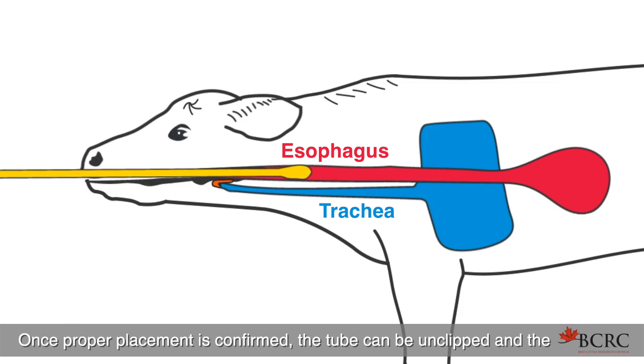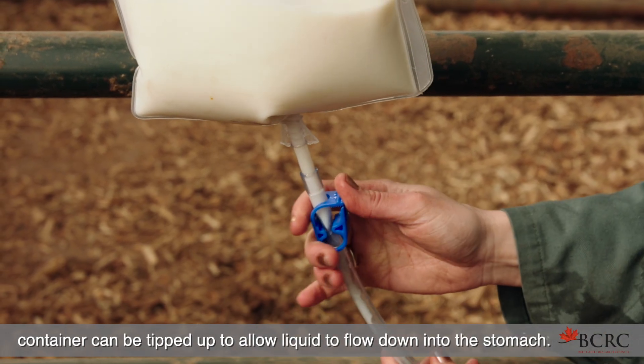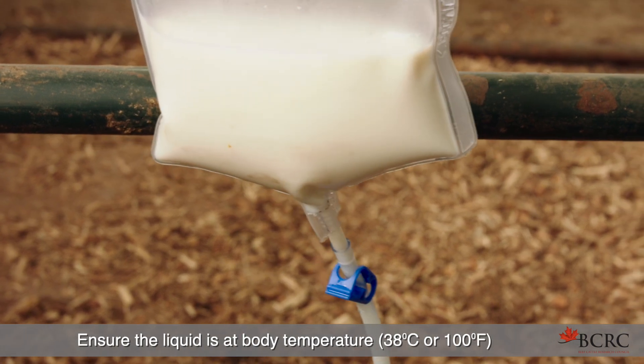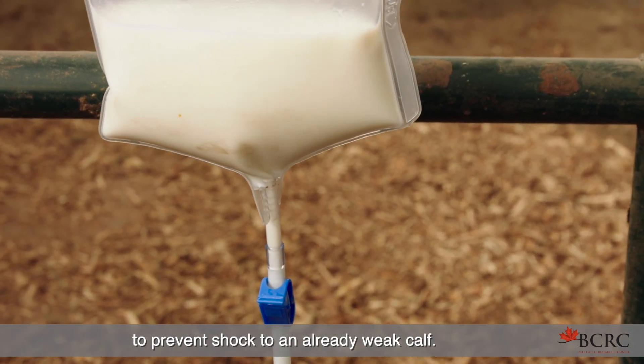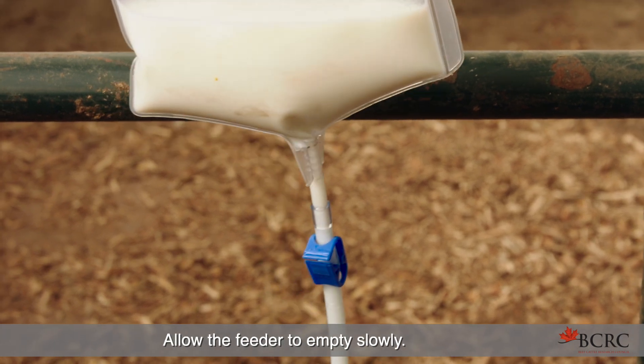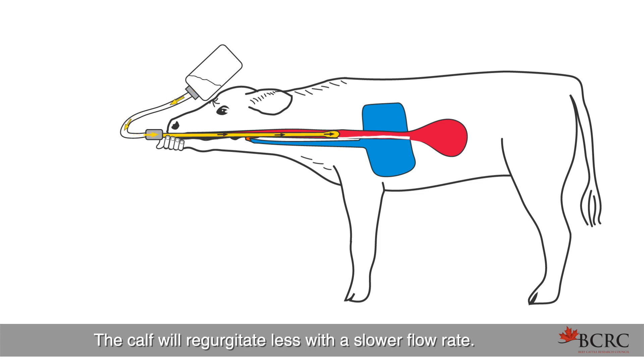Once proper placement is confirmed, the tube can be unclipped and the container tipped up to allow liquid to flow down into the stomach. Ensure the liquid is at body temperature, or 38 degrees Celsius, to prevent shock to an already weak calf. Allow the feeder to empty slowly — this could take upwards of three minutes. The calf will regurgitate less with a slower flow rate.